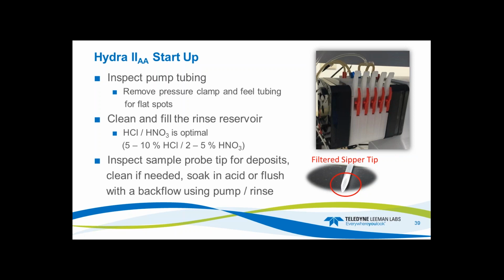Startup. So that was the conclusion of the quick software overview. So startup, let's do this. Let's inspect the pump tubing. Remove the pressure clamps, and you want to feel the pump tubing for flat spots. If you have any flat spots happening, or it looks like it's starting to wear, just go ahead and replace the tubing and replace the whole set at one time.